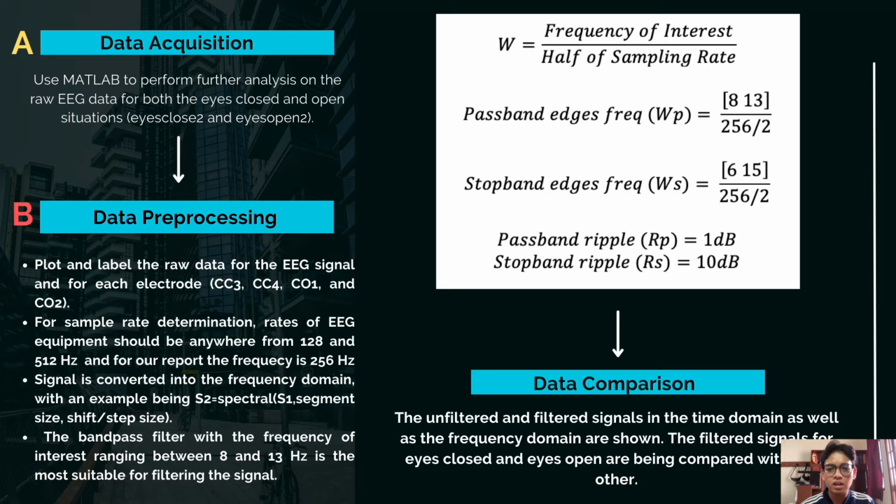Lastly, for the data comparison, the unfiltered and filtered signals in the time domain as well as the frequency domain are shown. The filtered signals for eyes closed and eyes open are compared with each other.